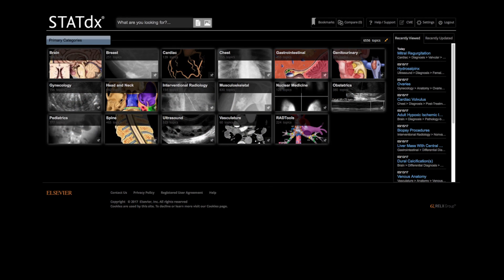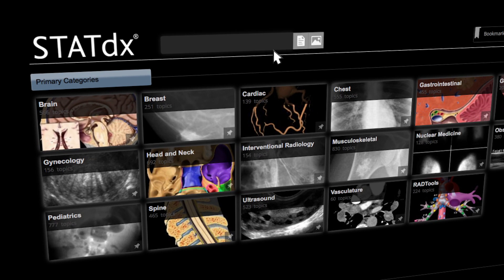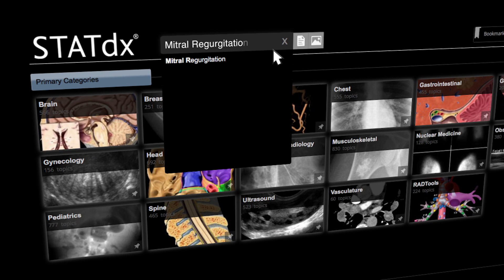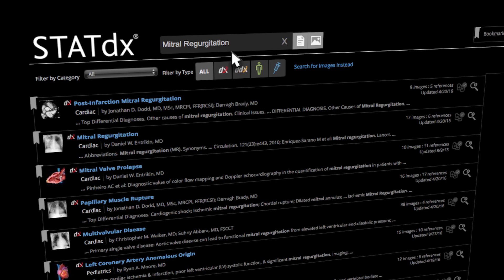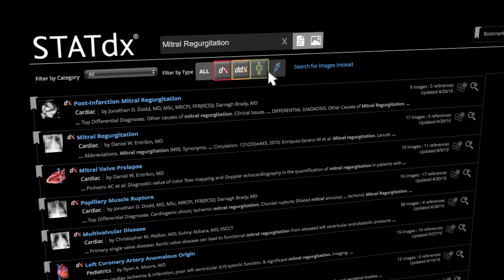Waste no time by jumping directly into a category or by searching specific keywords. Furthermore, searches can be previewed, limited by category, type, or by images.